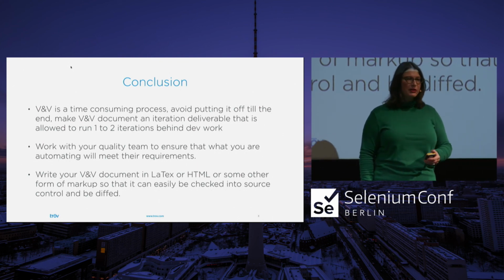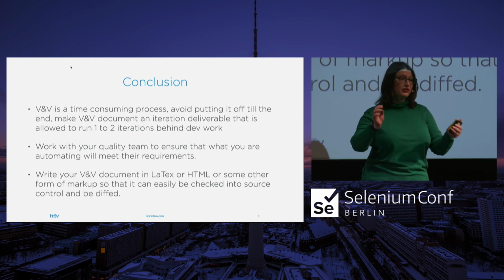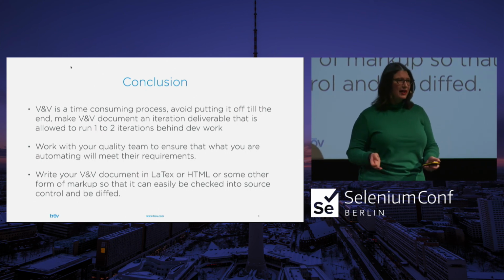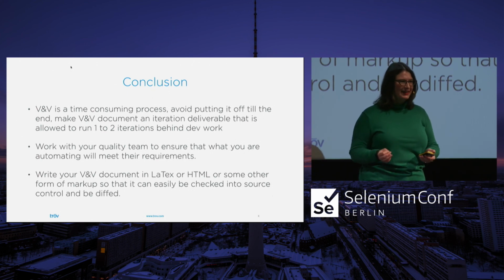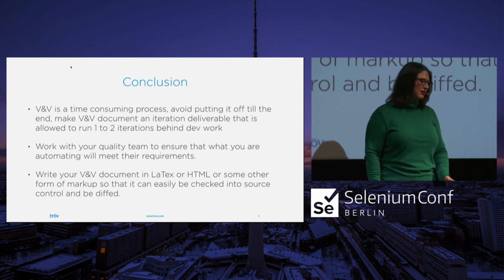Because a giant Word document is a mess. You're going to pass around 20 versions of it. You're going to store it on Google Drive. That's going to be your backup. You're going to put it on Google Drive and your wiki as your backup. This is a terrible idea. And you're going to lose your changelog because you're maintaining that manually. It's not automatically maintained for you. That's a lot of work. You do not want to get involved in that.